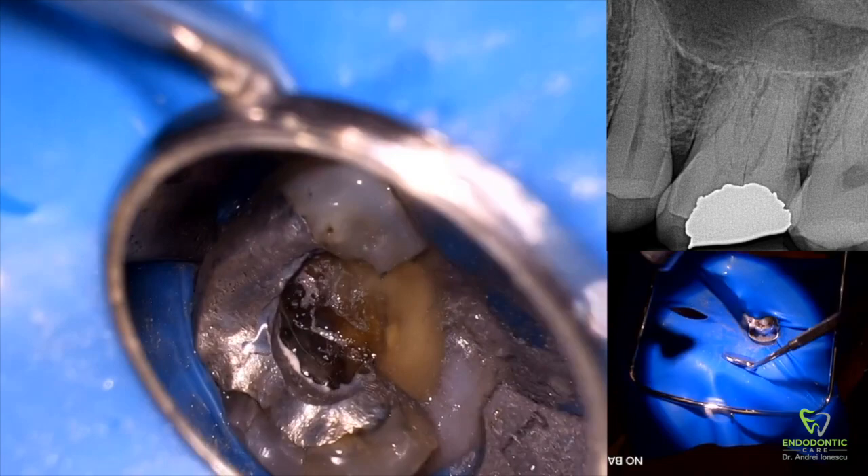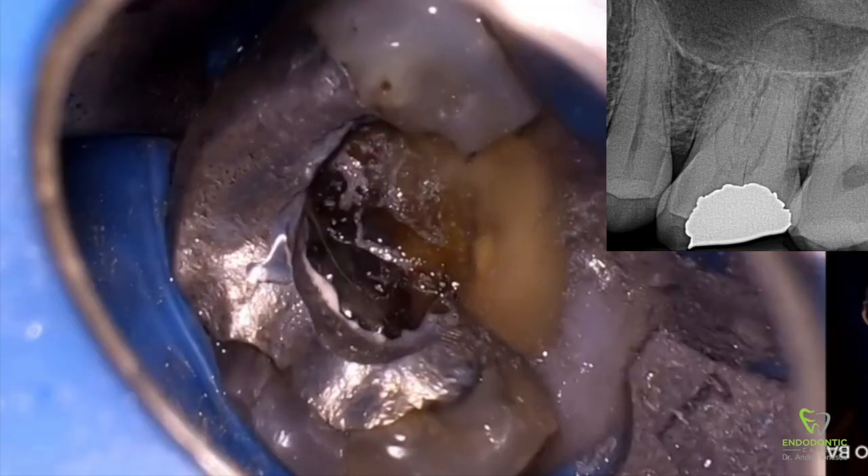Now that the amalgam is cut back, we can really stop and take a look at the tooth and make a map in our mind of where we need to remove dentin to expose the canals. The red dots indicate where I think the mesial buccal, palatal, and distal buccal canals would be. If we start removing dentin layer by layer we should eventually see pulp horns in those areas and get into the canals. Connecting the dots gives us a pretty conservative access.